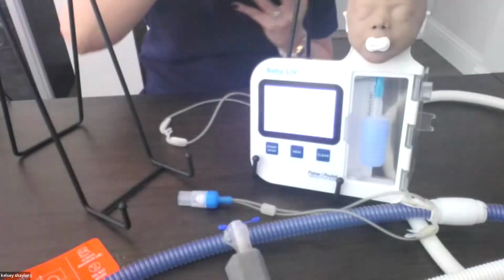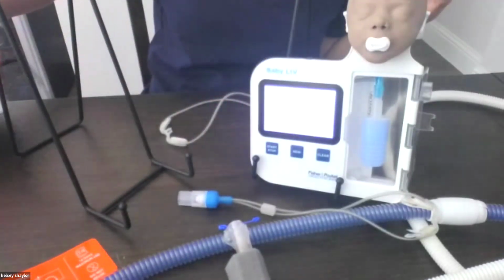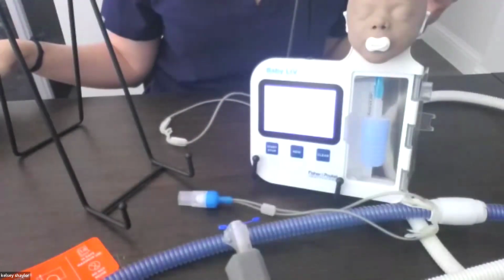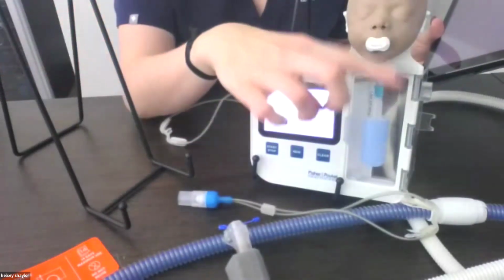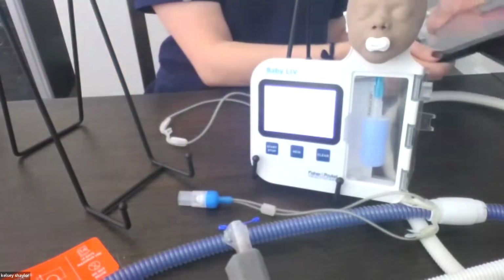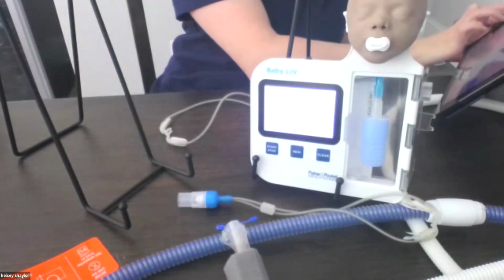While it's doing that, just to explain Baby Liv as well, I do have a flow generator over here on the side that will control my flow per minute. It's a little bit loud, so I apologize if that creates background noise. And then I also have the circuit hooked up to a bubble CPAP generator for this first part. And I do have the bubble set at a CPAP of 6. So I will do that just momentarily.